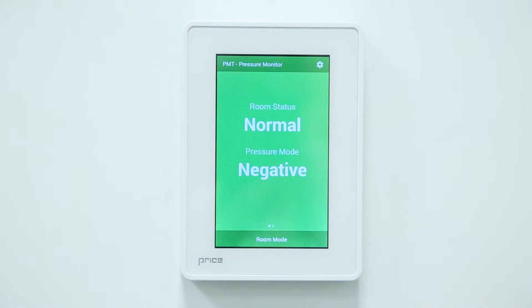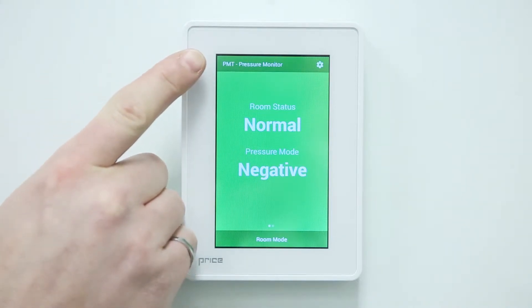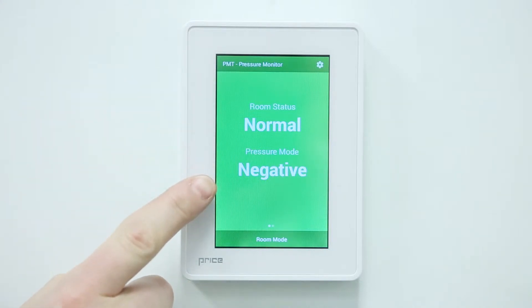The PMT is laid out over two pages. The first page is the home screen. The home screen provides monitoring information such as room name, room status, and room pressure, in a simple format.